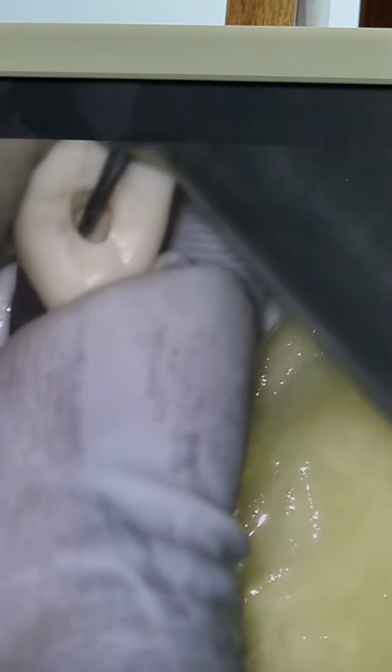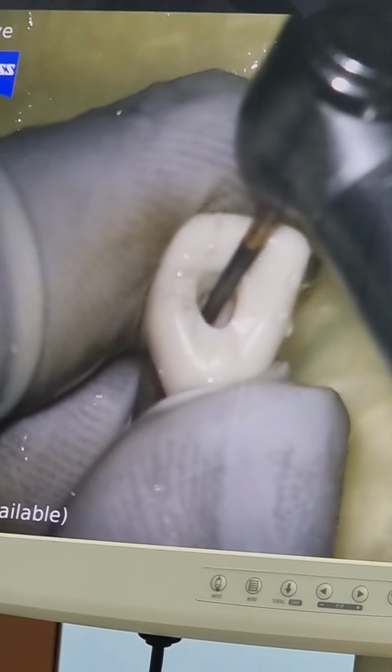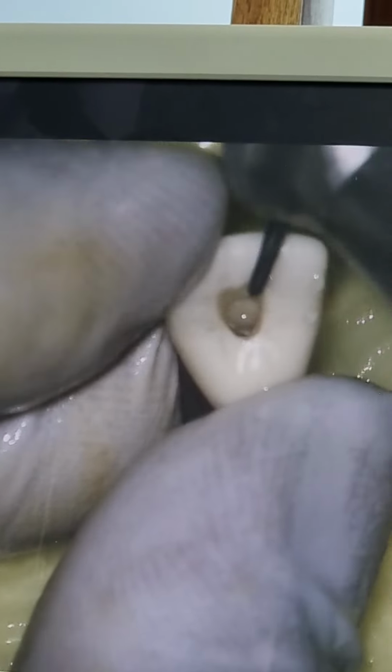And then how to use it? Just brush the burr, keep it along the walls. The shape of the burr itself will give you the proper shape of the walls. That is the divergence which you need for the tapering or funnel shape of the access cavity. The problem with the handpiece is that the burr is not getting locked inside. Okay, so I'm just smoothly finishing my walls.